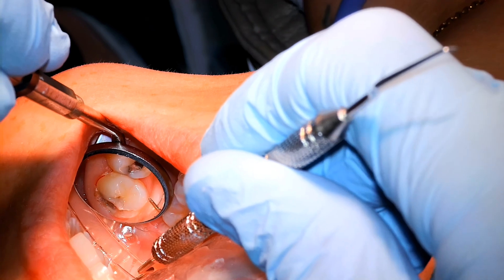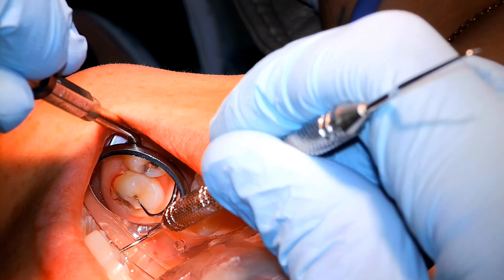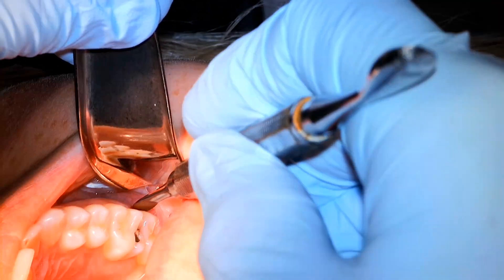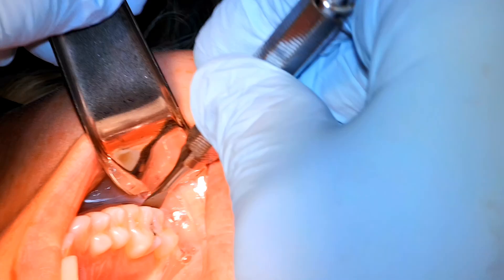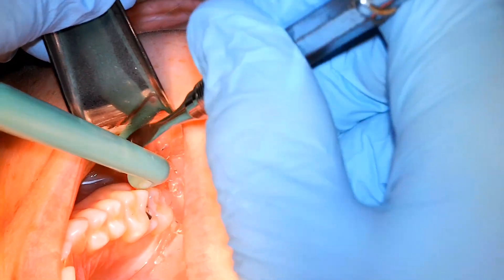When I have a sinus like this that's close down there and there's not a lot of bone around, I'm a little more judicious in terms of how much I'm going to push on a tooth. That doesn't mean we won't try to elevate it — which you'll see in a minute — we will try that and see how the tooth is moving.